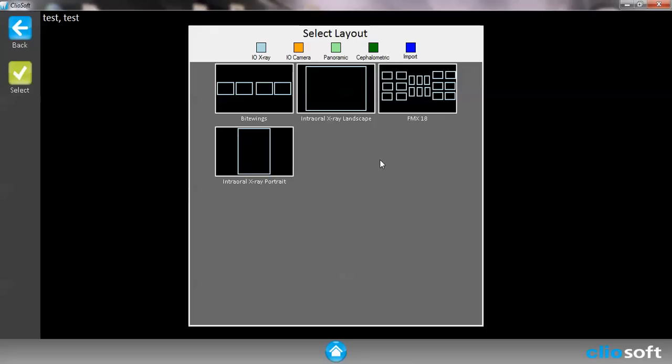Right off the bat in the ClioSoft database there's going to be four layouts that we have pre-loaded onto the database. However you can go ahead and make as many different kinds of layouts as you want and we're going to discuss that in a future video.